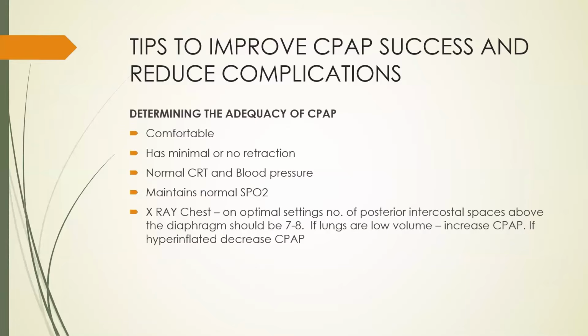So we can determine the adequacy of CPAP in the following ways. The baby should be comfortable while on CPAP, should have minimal or no retractions. CRT and the blood pressure in the baby should be normal, and the baby should maintain normal SpO2.